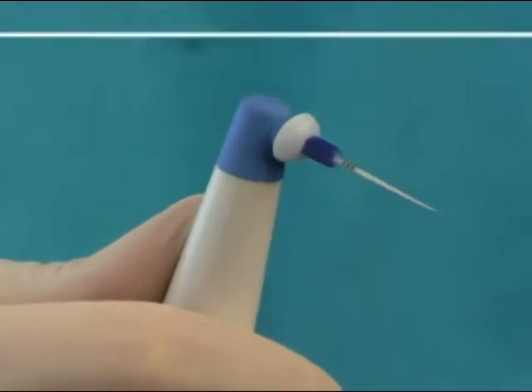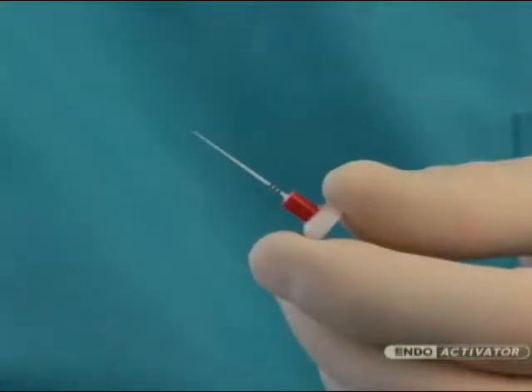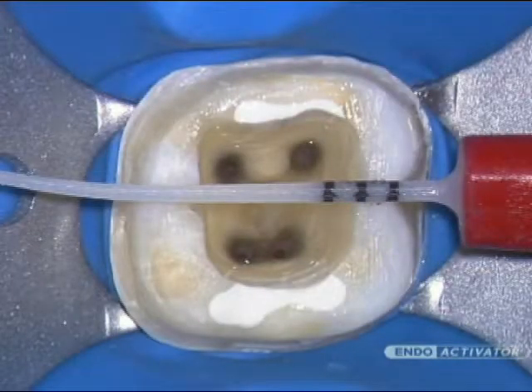Importantly, the tips are made from a medical-grade polymer, are strong and flexible, and are 22 millimeters long. The bowl-shaped clean guard serves to consolidate the protective barrier and orientational depth gauge rings are positioned at 18, 19, and 20 millimeters.